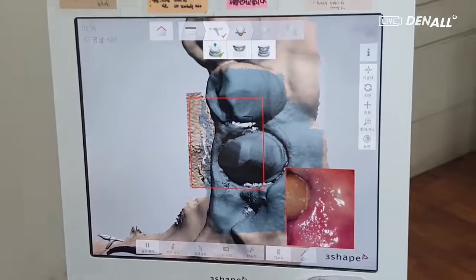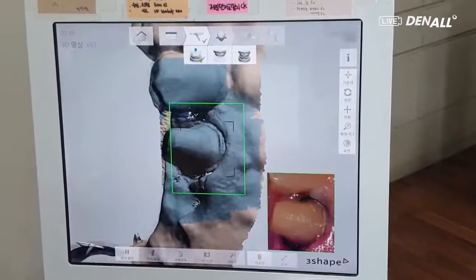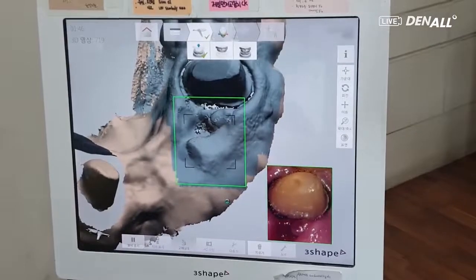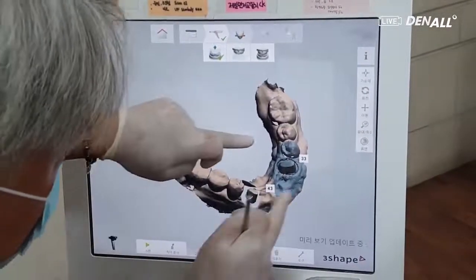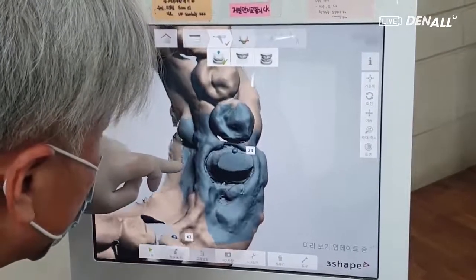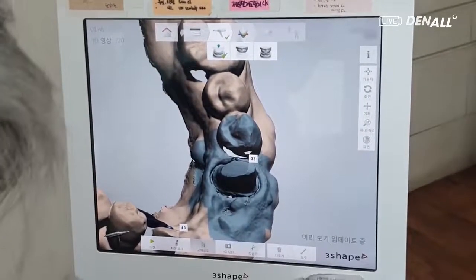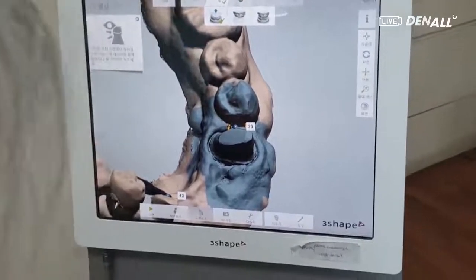The precise data with a clear margin is required to fabricate a prosthesis without a model, to produce satisfactory fitting for the patient, contact points with the adjacent teeth, and occlusion with opposing teeth, and to reproduce them properly. Therefore, in acquiring scan data, we try to get very precise data patiently, like this.